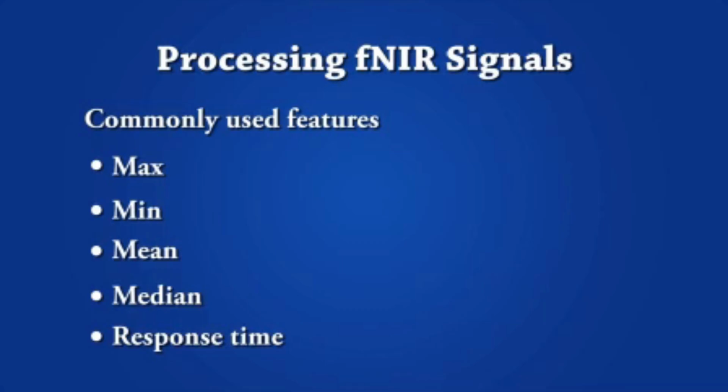These features can be extracted within an evoked hemodynamic response to certain cognitive stimulus obtained through the use of single trial paradigms, or with data epoch or block of data corresponding to certain conditions implemented through block trial designs and paradigms.